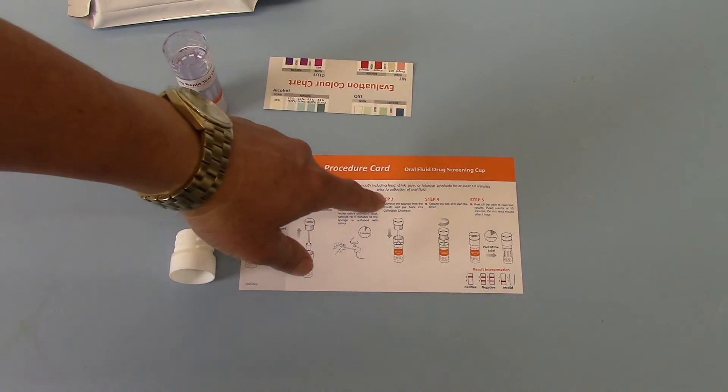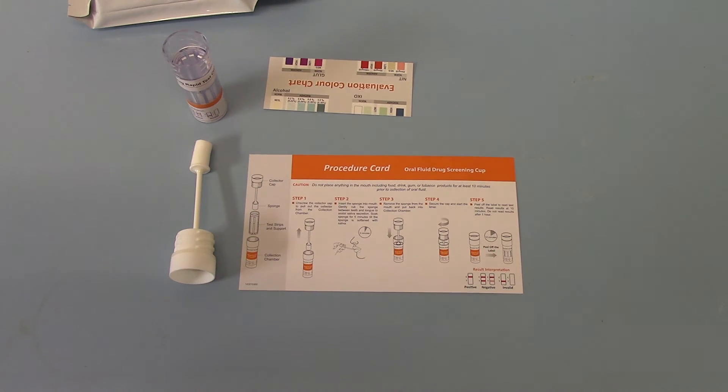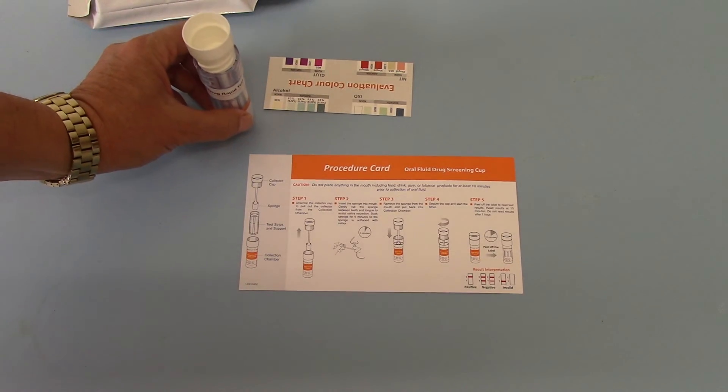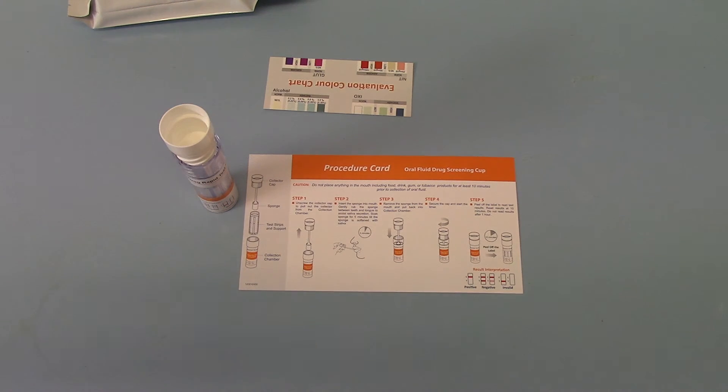It also then runs you through putting the test back together by screwing the cap down into the barrel of the test. The saliva is discharged to run on the 12 test membranes, and then guides you in terms of reading the results at 10 minutes for this test.